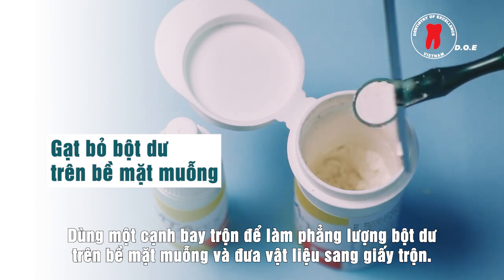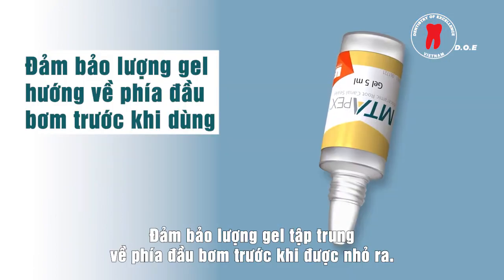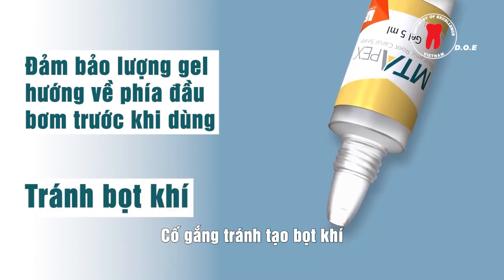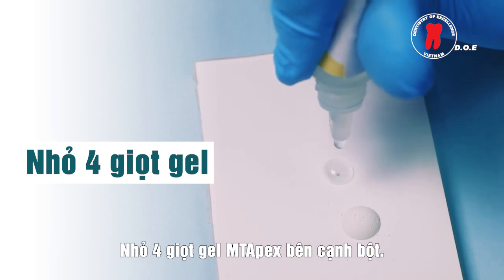To dispense the gel, shake the bottle three times. Ensure all the gel is concentrated in the spout of the bottle before squeezing drops out. Try to avoid any air bubbles. Dispense four drops of the MTApex gel.